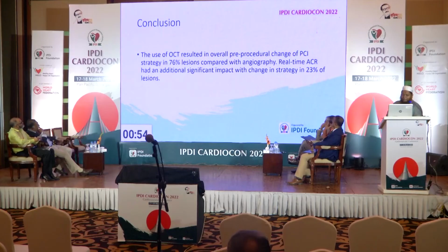So OCT results overall 76%, and real-time ACR an additional 23%. From this result, we can say that OCT with ACR significantly improved the immediate and long-term outcome of PCI.